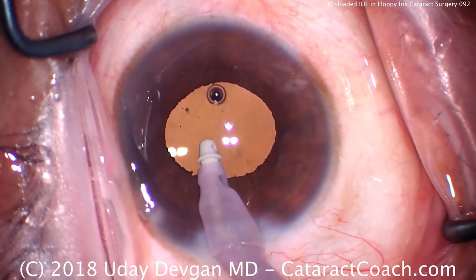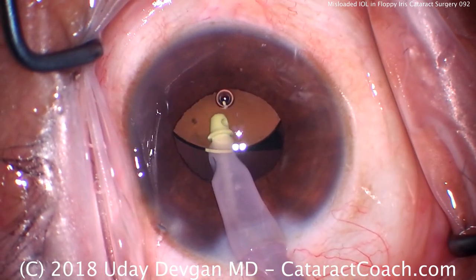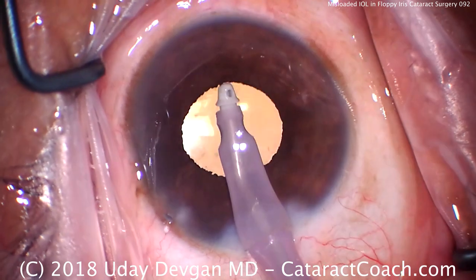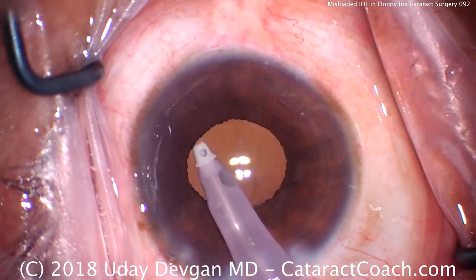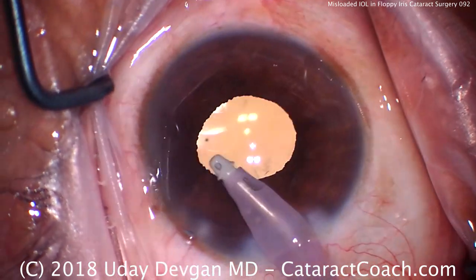High flow here. As the viscoelastic comes out, we'll notice that the pupil does come down — it's a little bit floppy. Going behind the lens to remove viscoelastic. Let's get the lens centered up. I also want to show you at the end of the case how we deal with the floppy iris when we're sealing up the incisions.